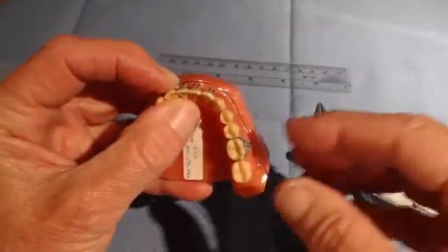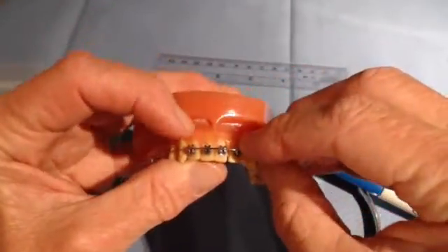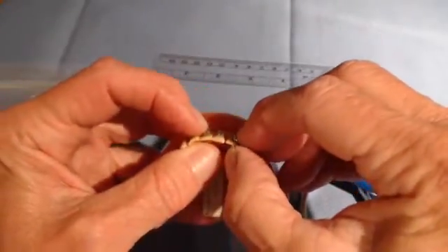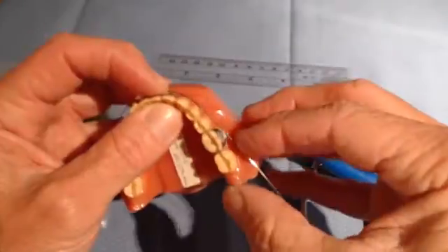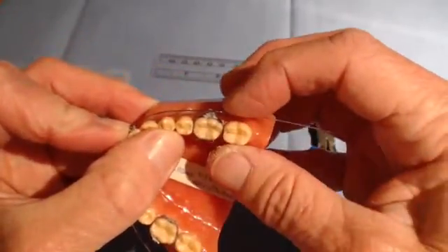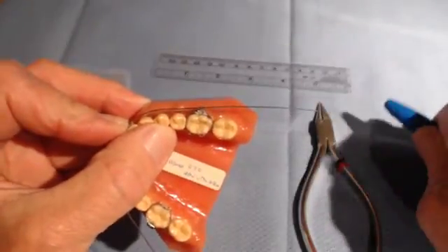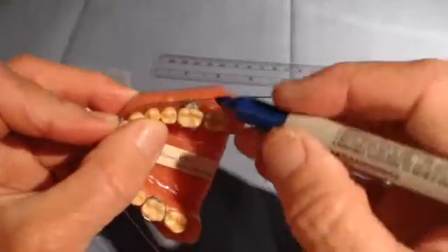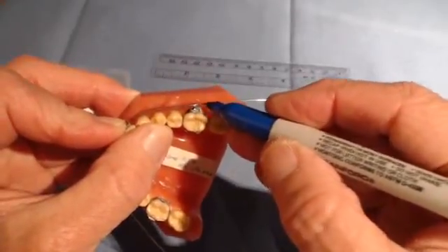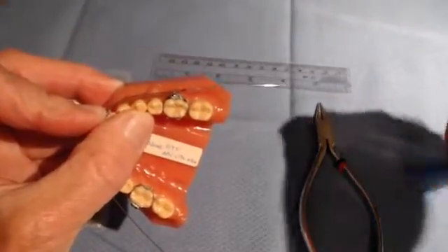The lower incisor teeth have been previously aligned with a sectional ni-tie wire because they must be straight for an 020 stainless steel to go in there. The next step is to mark one side two millimeters distal to the tube, because this is where the first bend will be made. So I will mark that two millimeters distal to the tube, and you can clearly see that mark.